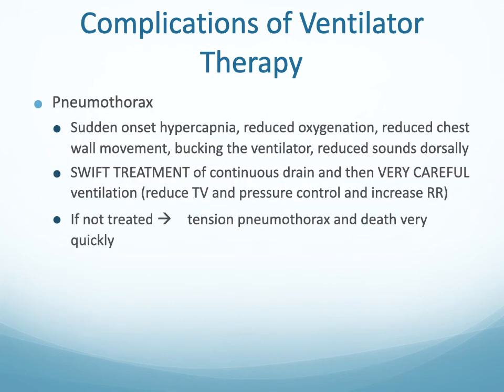Another known complication of ventilator therapy is pneumothorax. It's a dangerous one.